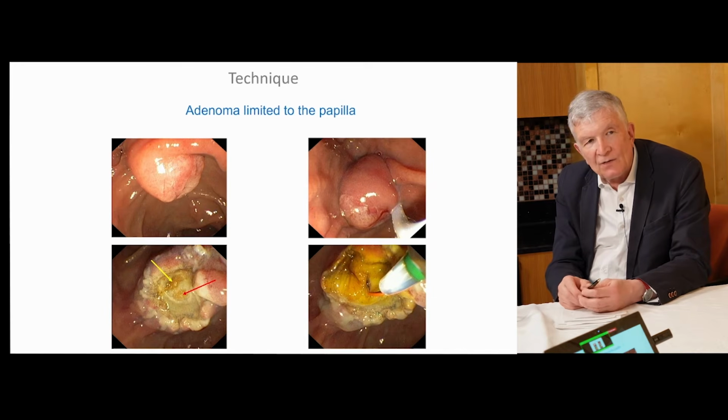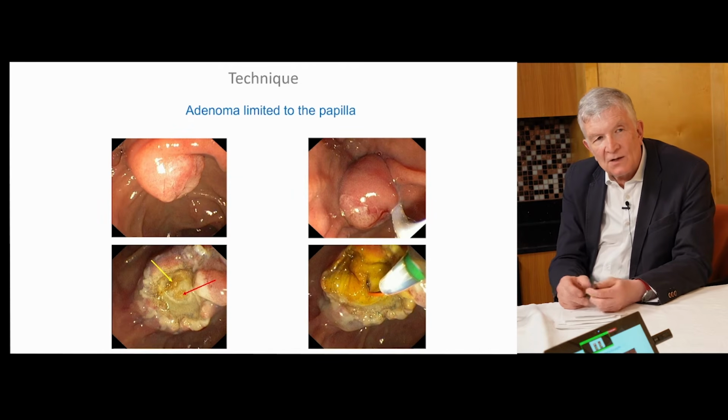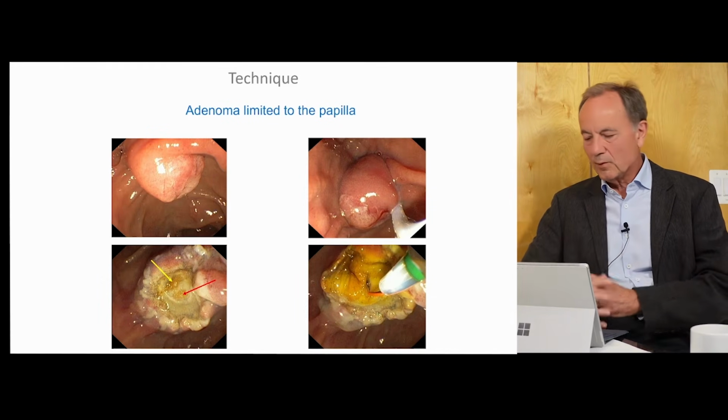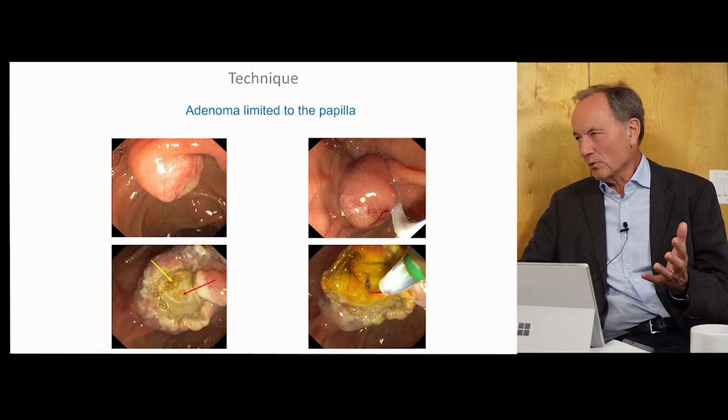if you have a gaping orifice like this one, a stent is not needed. A gaping pancreatic orifice. Yeah, but we don't know. According to retrospective studies and to this randomized controlled trial, the risk is lower. So this is just what means wide opening. Probably they are right, but there are no studies to prove it.